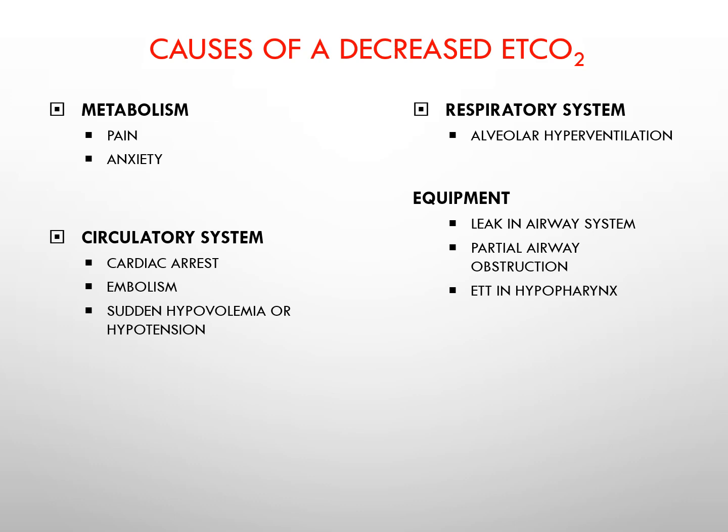As far as equipment goes, some of the things that we discussed previously in the presentation, there could be a leak in the airway system, a partial airway obstruction, or the ET tube is just not properly placed. It's not in the trachea. It's in the hypopharynx, or it's in the esophagus.